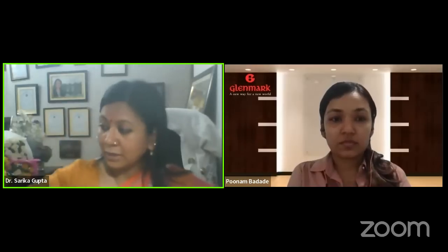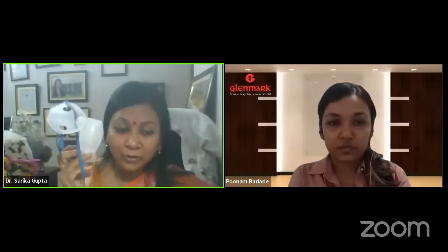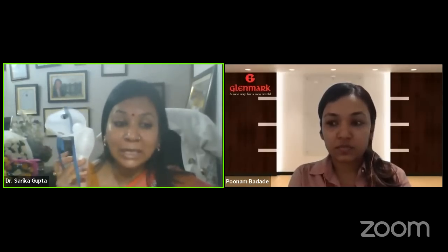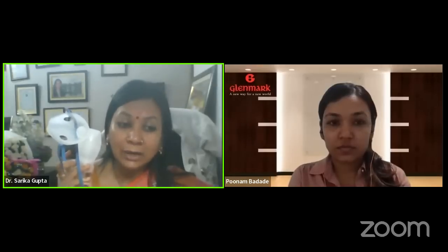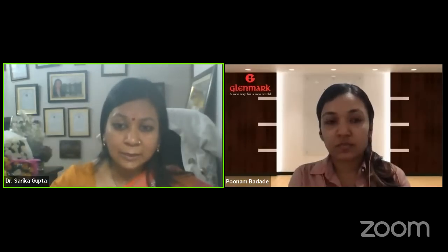If this chamber is containing 0.5 or 1 ml of solution, you need not empty that. You have to just concentrate on the spluttering sound. It is coming, continue nebulization. It has stopped. Continue nebulization for 1 minute after the stoppage of that sound. Right?